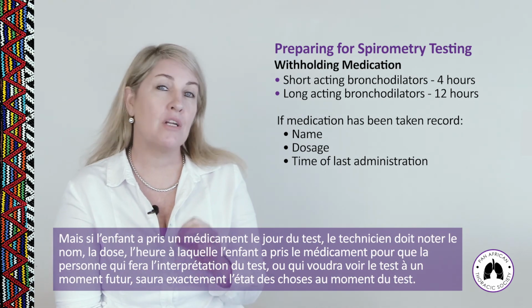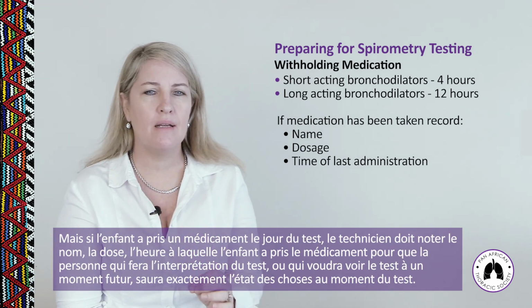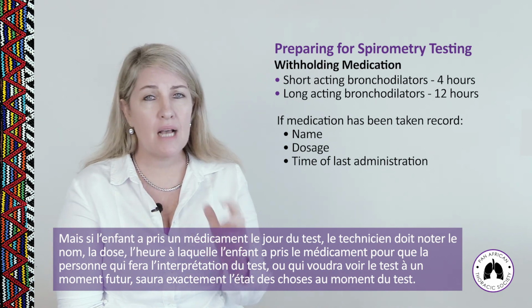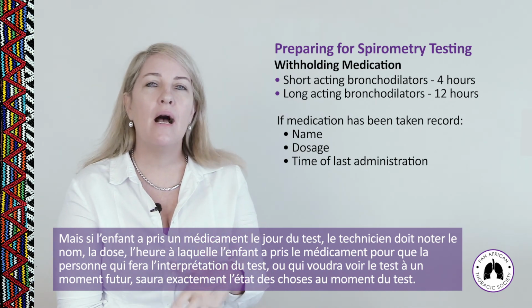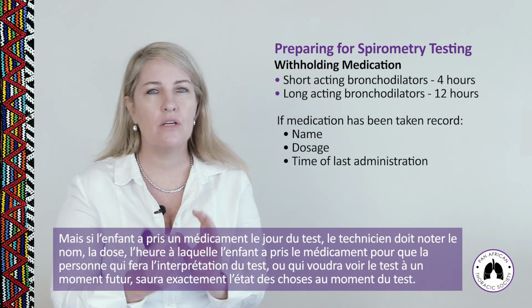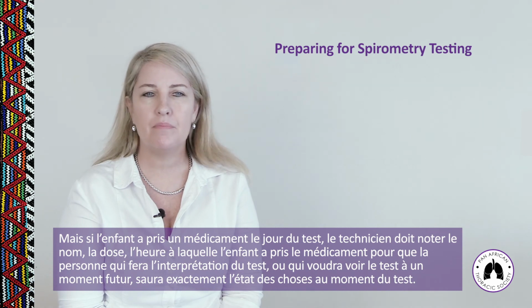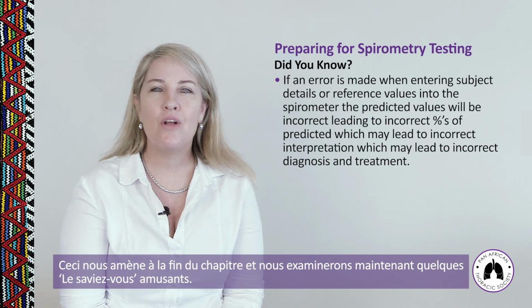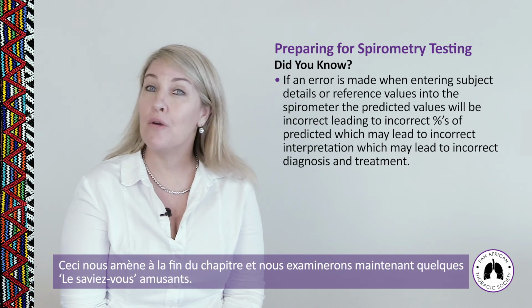But if medication has been taken on the day of testing, the technician needs to record the name, the dosage, the time that the medication was taken, so that the person who is interpreting that test or picking up the test at a later date knows exactly what happened. That brings us to the end of the chapter on preparation, and I'm quickly going to go through a few fun did you knows.